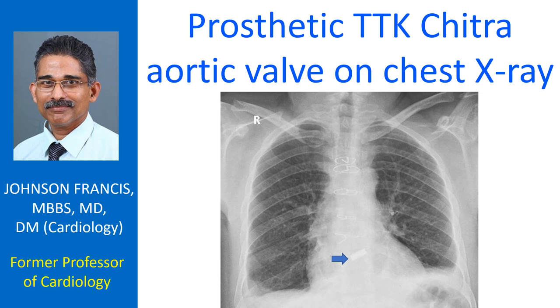X-ray chest PA view showing a prosthetic aortic valve within the lower portion of the cardiac silhouette, overlapping the spine. Multiple sternal suture wires are also seen on this chest X-ray. There is mild obliteration of costophrenic angles suggesting minimal pleural effusion.